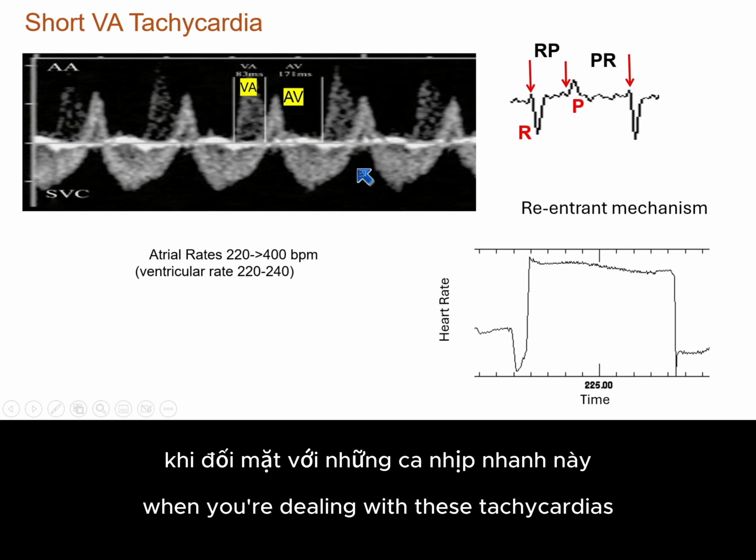Sotalol is the first treatment of choice. Let's look at some other pictures. So here's a picture of intermittent atrial flutter. Again, just look at how the atrium are contracting or just kind of quivering. This is an aorta and an SVC tracing of atrial flutter. These are the V waves here. You can see the atrial contractions here.